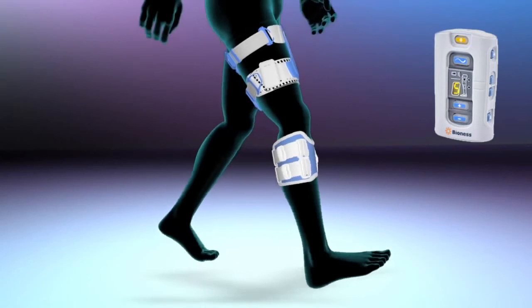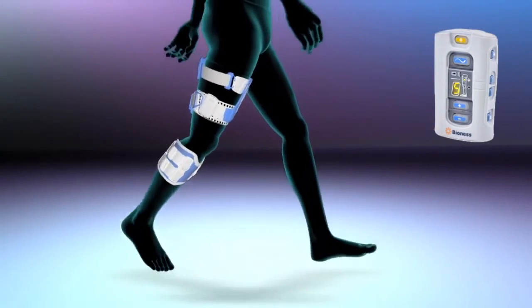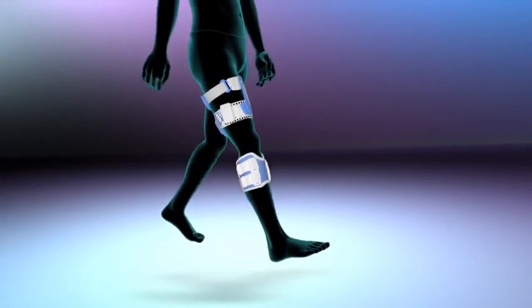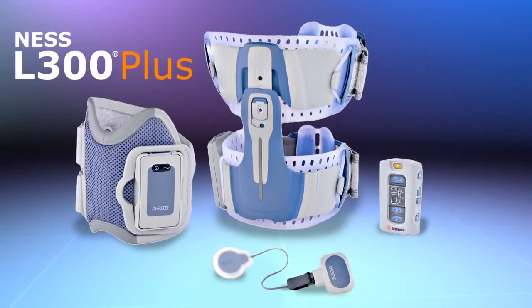The wireless control unit allows simple operation while displaying real-time information regarding the system's status. Get in step with the latest breakthrough in gait rehabilitation — enjoy the freedom of walking more naturally with the Ness L300 Plus system.